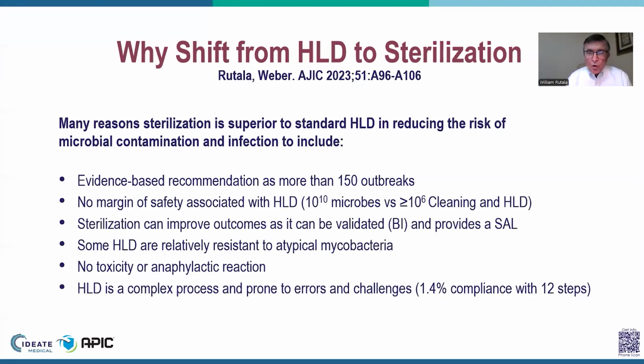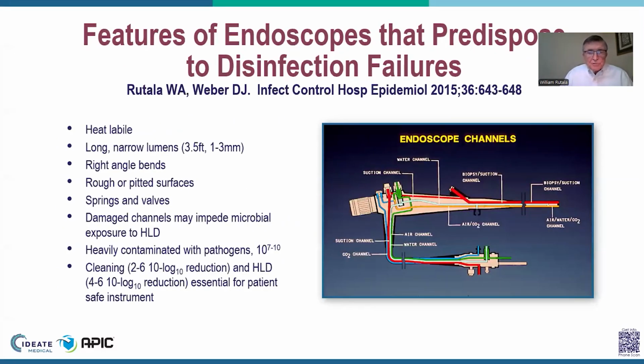And when they did, there was only 1.4% compliance with those 12 essential steps. So essentially, we have errors and challenges associated with reprocessing because, of course, it's a complex medical instrument and reprocessing is very complex. The next slide, essentially, we will see the complexity of this instrument.